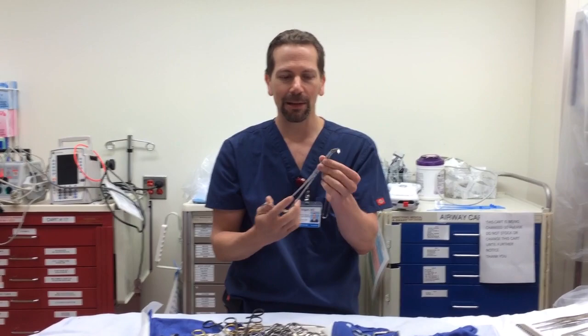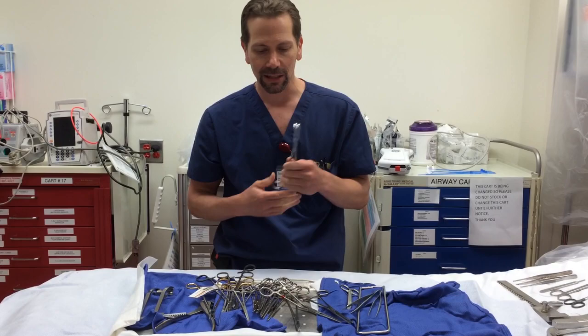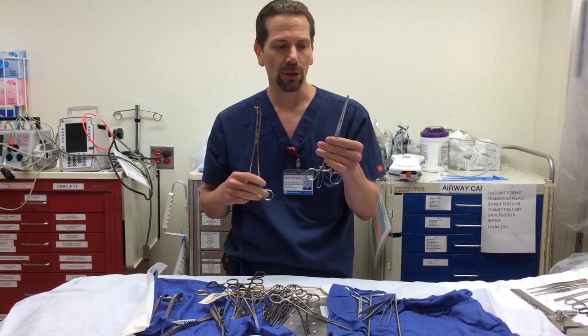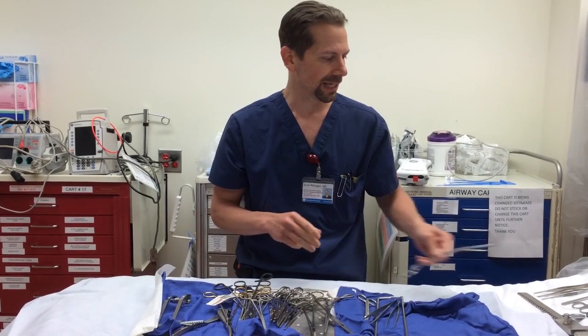The side-biting Satinsky can clamp the aorta, the hilum, or any vessel you need from an ED perspective. I would stock two Satinsky clamps in preference to straight vascular clamps, unless you're confident your team won't grab the wrong ones. So I'd put two Satinskys in the tray.